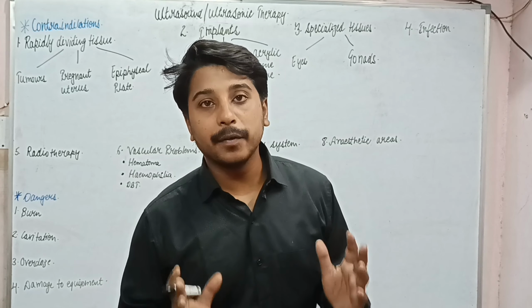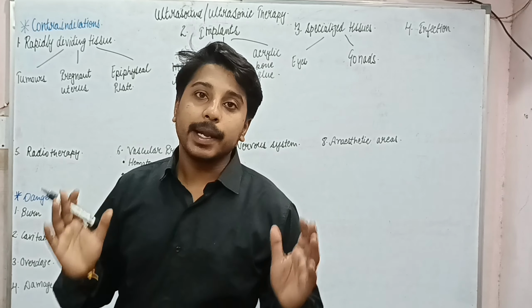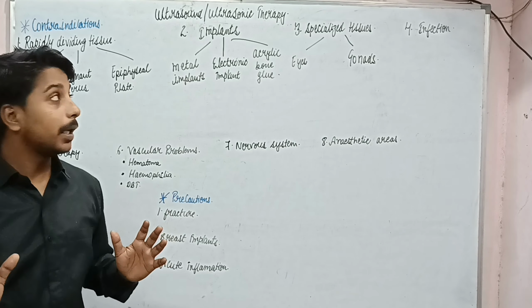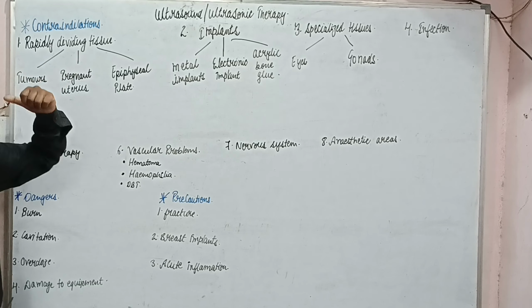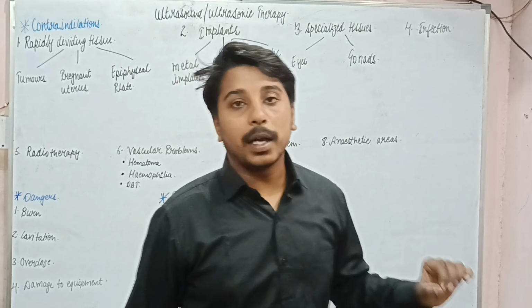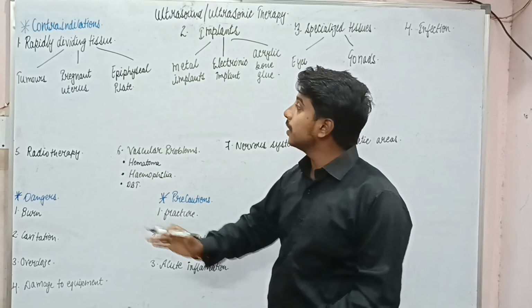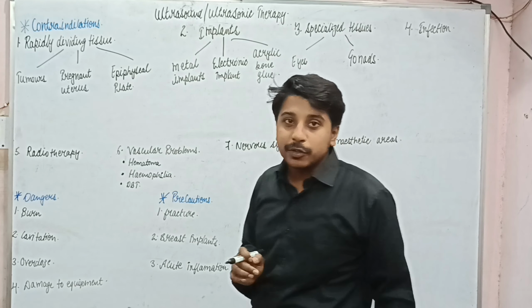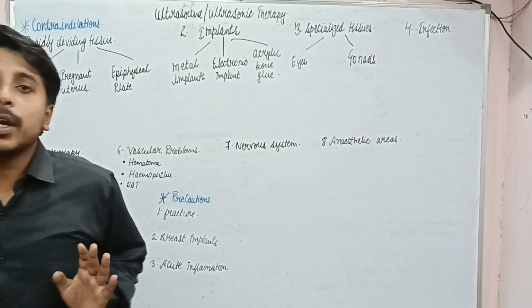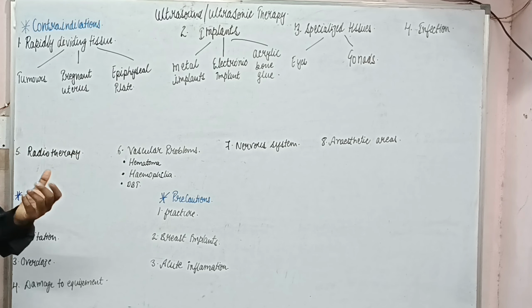We are back with our next lecture on ultrasound therapy. Here we are going to study the contraindications, dangers and precautions of ultrasound therapy. The first contraindication is rapidly dividing tissue. There are different conditions in which the tissue is dividing rapidly.